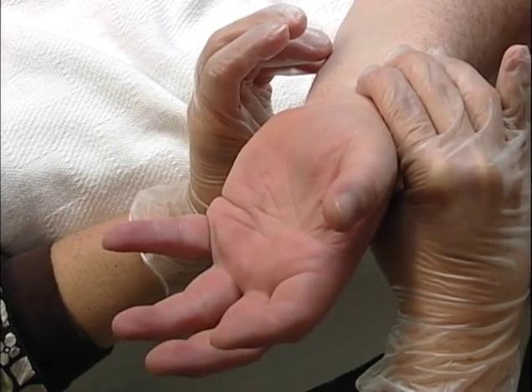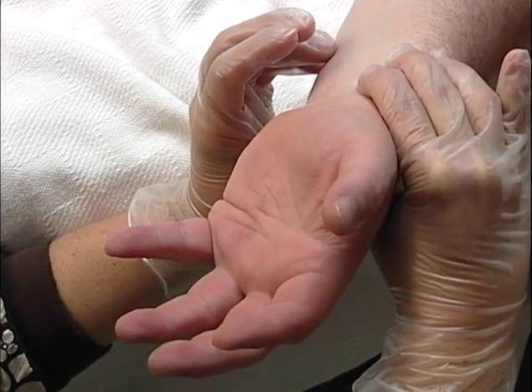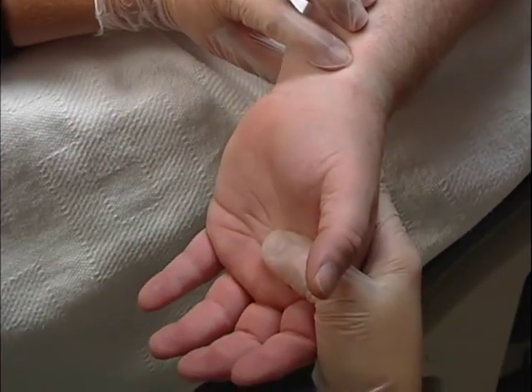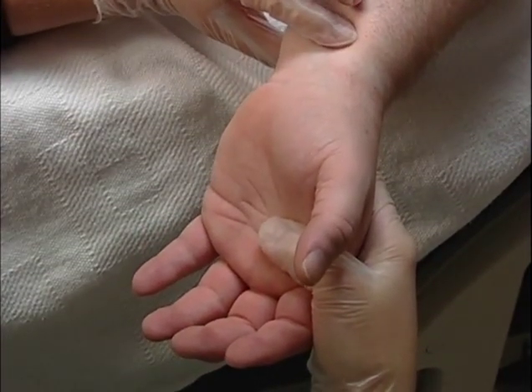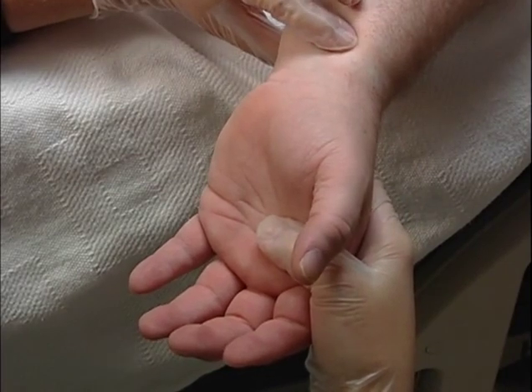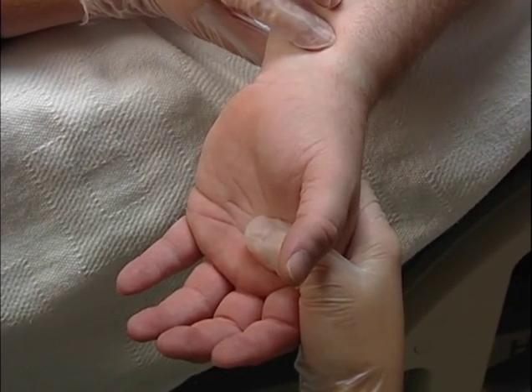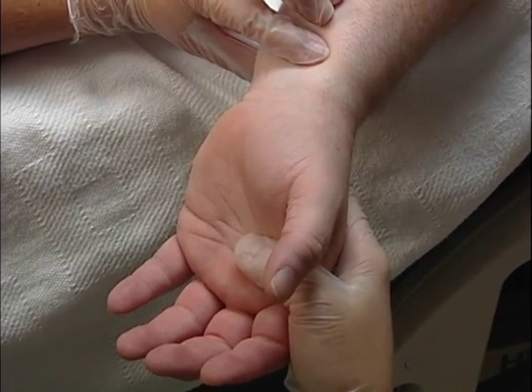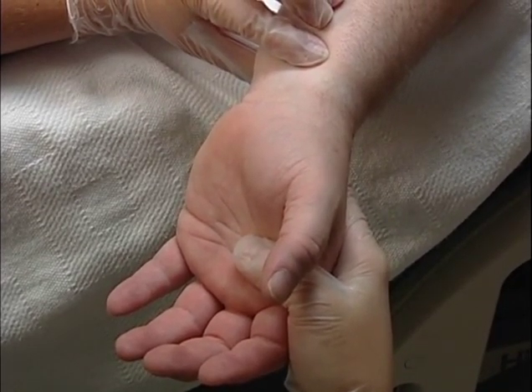If the skin color returns to normal within 15 seconds, the Allen test is positive and you can proceed with the radial puncture. If the palm remains pale, the Allen test is negative and the radial artery should not be used for the procedure. For unconscious patients or those unable to cooperate, follow your facility's policies.